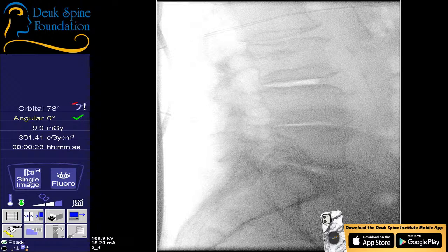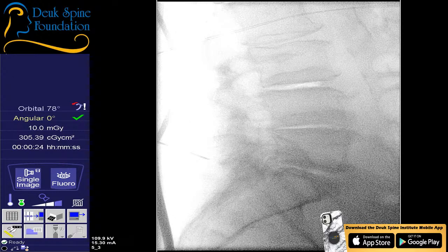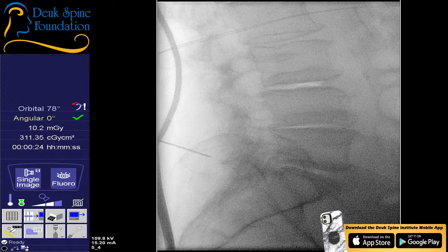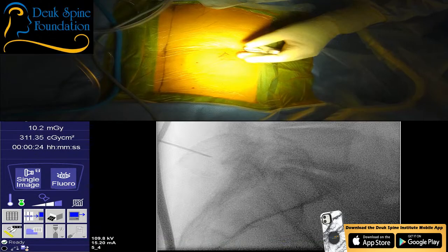Are you comfortable? Let me know if it hurts you, okay? Shot. So I've got to navigate down. It's a little overexposed, just a little bit. Not too bad. I could live with it. All right. So I got to make my way down to the pedicle, I mean to the disc.